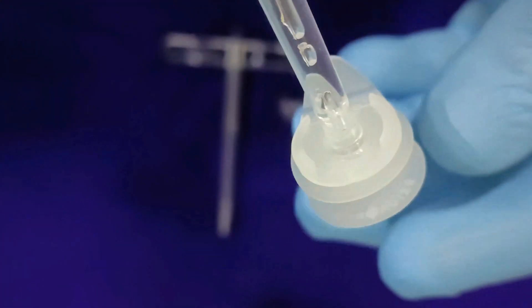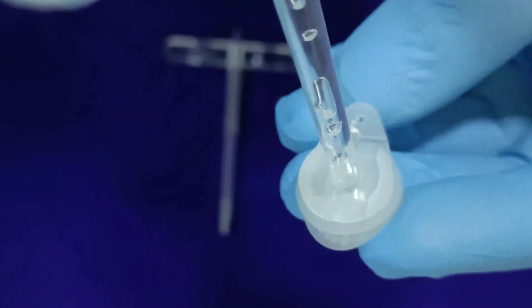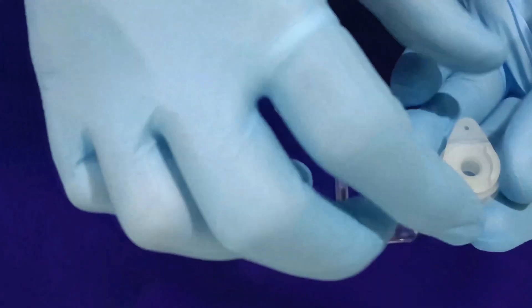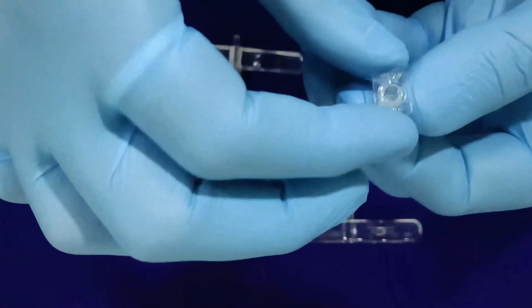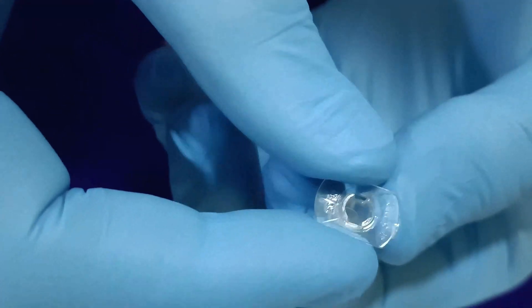With the outer cannula mounted on the inserter, insert the voice prosthesis outer cannula into the surgical puncture site. Remove the outer cannula flange from the tip where it was fixed earlier and rotate the outer cannula inserter 90 degrees clockwise for releasing the locking mechanism, then pull out the outer cannula inserter. Ensure that the outer cannula is positioned such that the FR marking is visible on the top end with the outer flange visible on the bottom end.